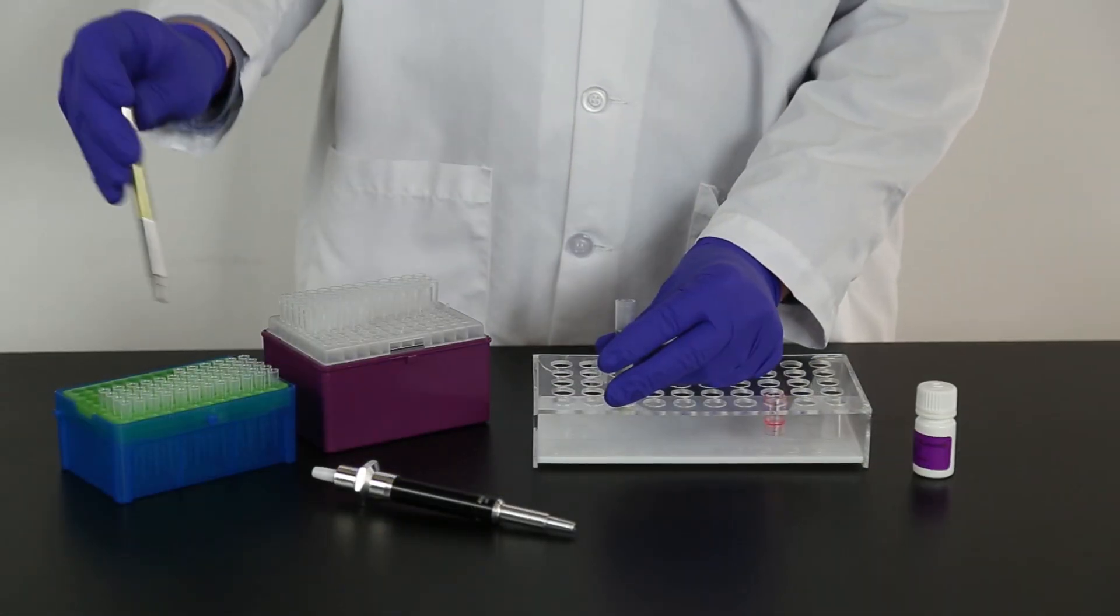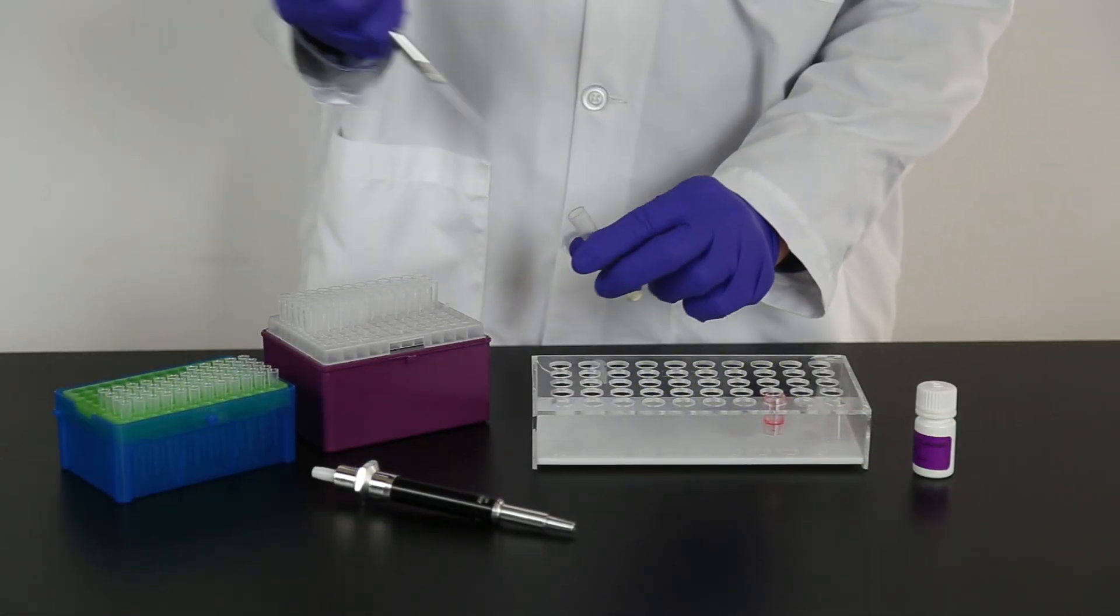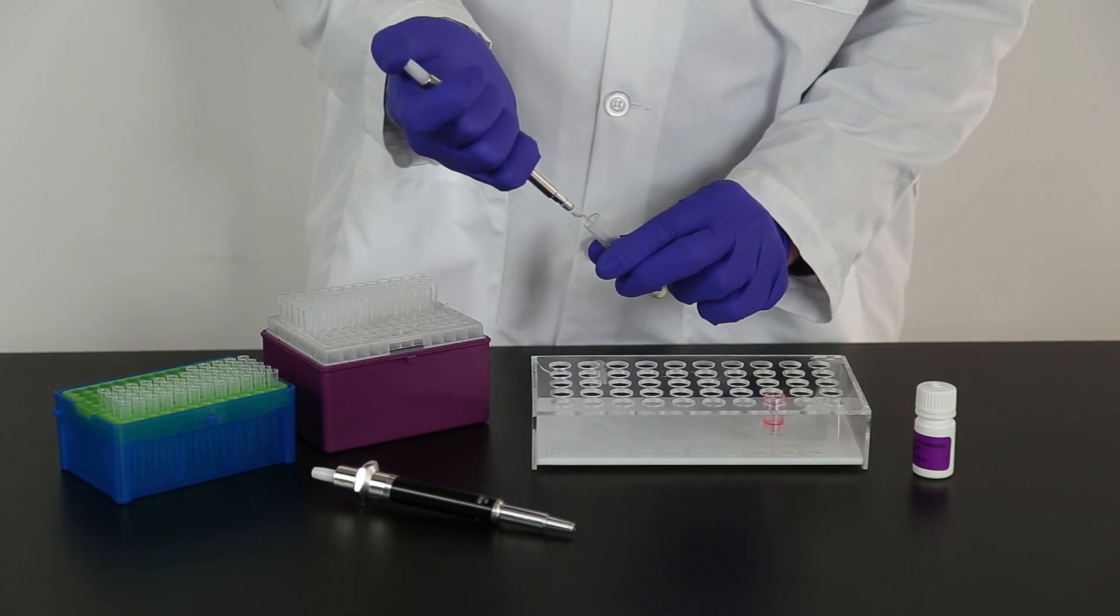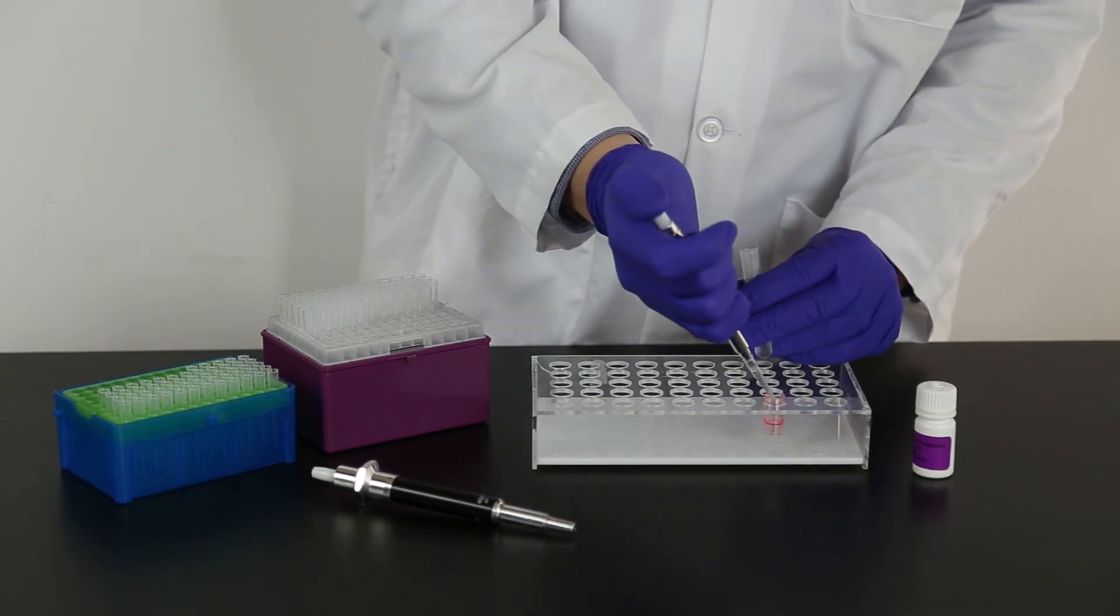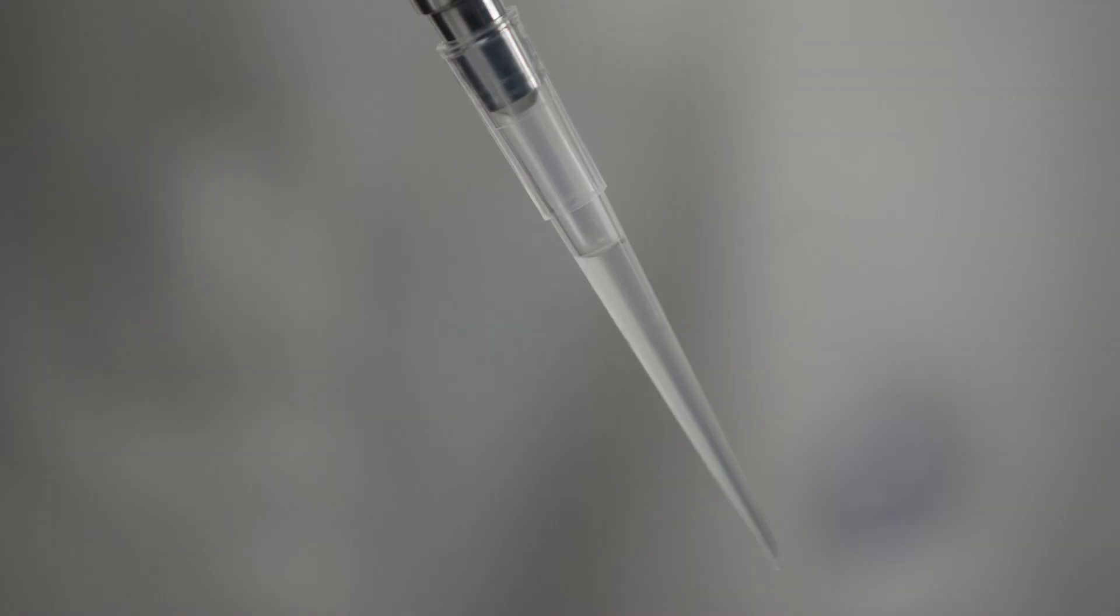For each sample you are testing, place a red dilution cup into the sample rack. Add 200 microliters sample to the red dilution cup. It is important to make sure the pipette tip is fully charged with liquid and doesn't have any air bubbles prior to dispensing the liquid into the cup.